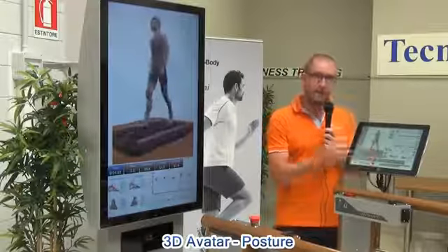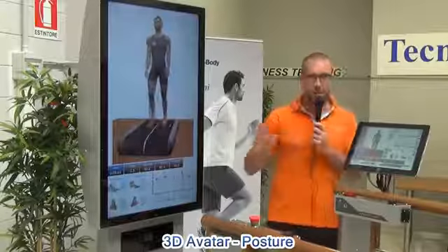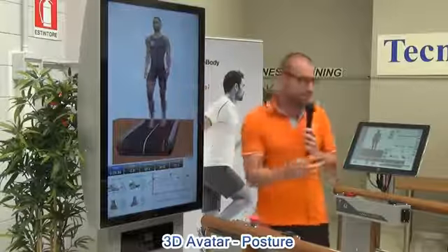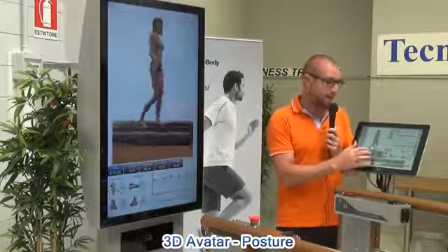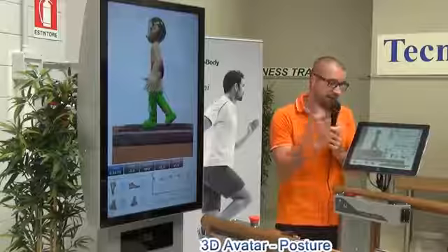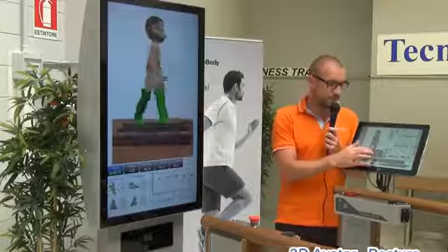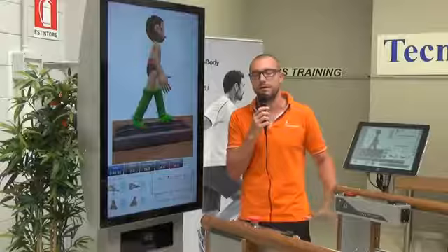Very important to give other kinds of feedback, other kinds of information. As you can see here, I selected a man as an avatar, but there is a possibility to switch to a female avatar, and even for the kid, a kid avatar, something very easy, something more fun, even for the little patients.